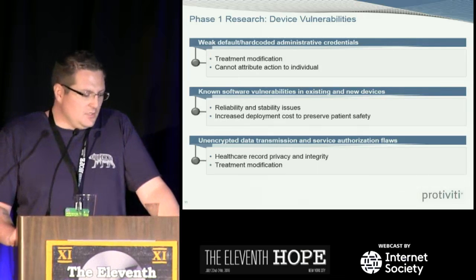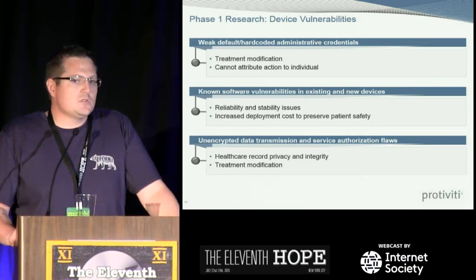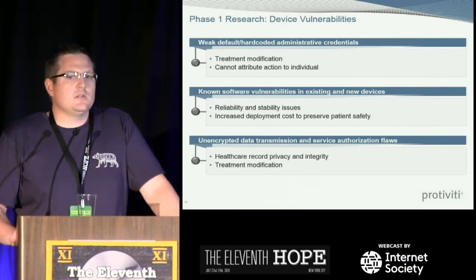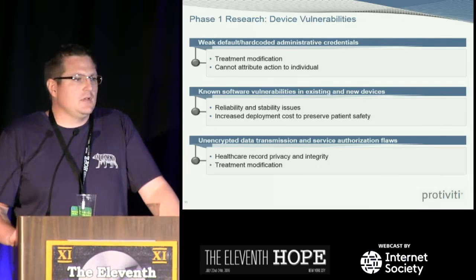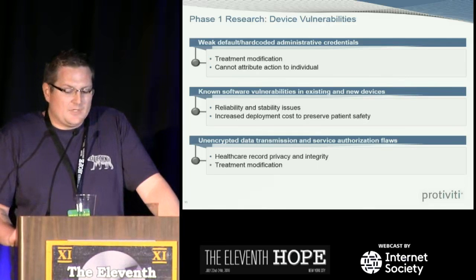The second is known software vulnerabilities, and to Adam's point, we still see a lot of XP, even older, 2000, NT, regularly still in operation. Legacy devices with known vulnerabilities that are open to exploit. And lastly is lack of encryption.